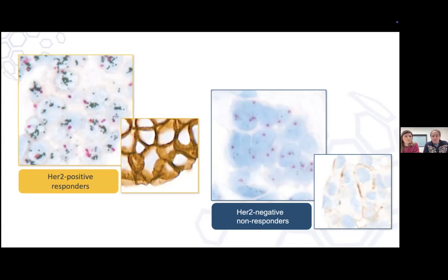And the result of this amplification was expression of the protein. The protein was a target, and it was biologically disturbed by the antibody trastuzumab, and the patients were responding. So we needed to sort out those that didn't have it from those that did.